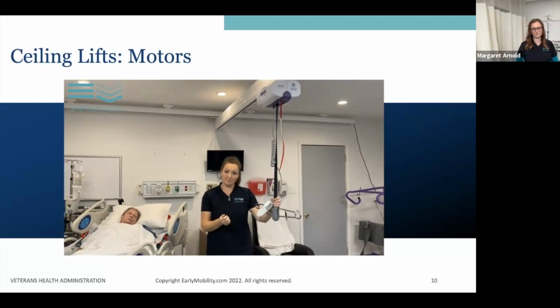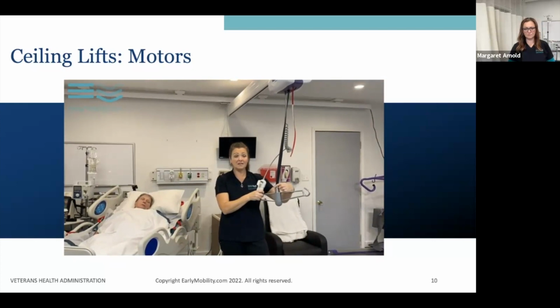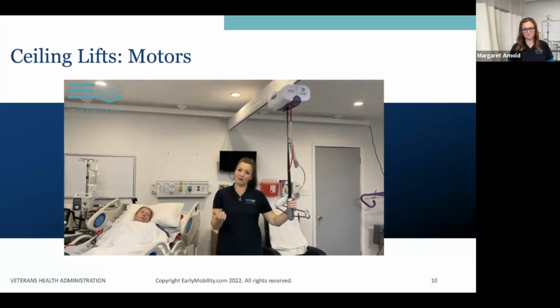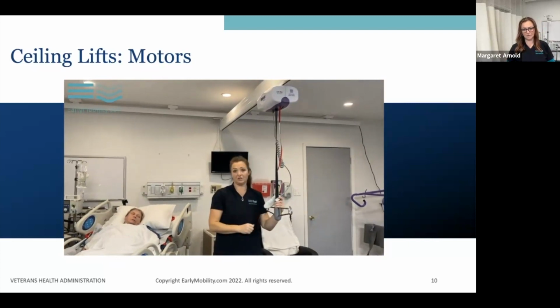Know if there's spare parts, if your service department keeps spare parts, spare hanger bars, spare pins, hand pendants. Oftentimes there are some spare parts in your facility. You should always know who to call and where to go if your lift is not functioning correctly.